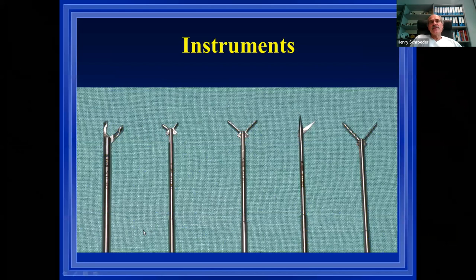Different instruments are necessary. This is a Decq forceps. It was a very good idea from Philippe Decq. There are the teeth outside. So these are used to puncture the floor of the third ventricle, and then you dilate, you open the forceps, and this dilates your fenestration.